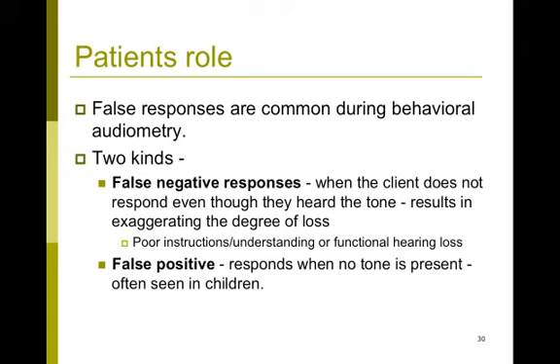You also need to be aware of what we call false responses, especially when you're doing behavioral testing. Most of those false responses are unintentional, and could be because of poor instructions or poor understanding on the patient's part. But you need to look out for intentional false responses, which could be a reflection of the patient having a functional hearing loss. There are two kinds of false responses.